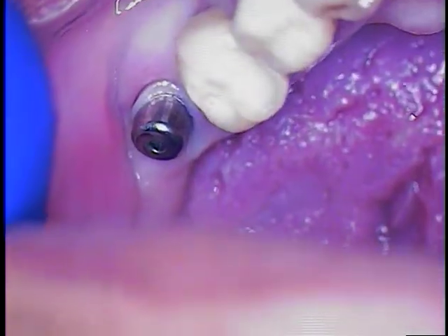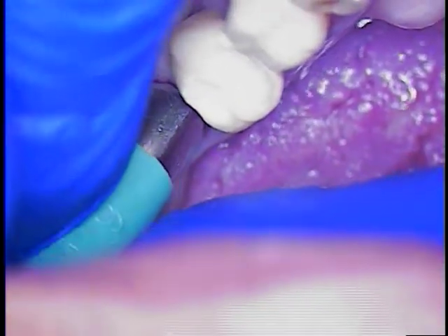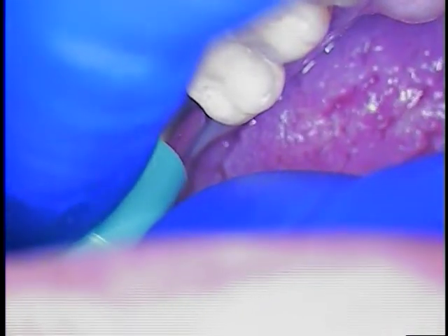Let's take a look and see what we got — there's some tissue right there. It looks like we're on the right track, so let's just stay with the form.